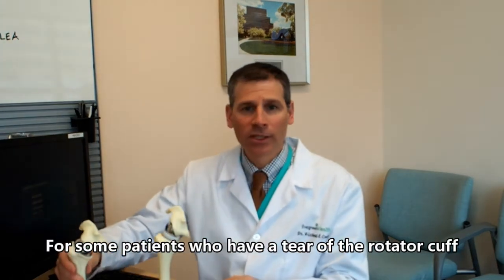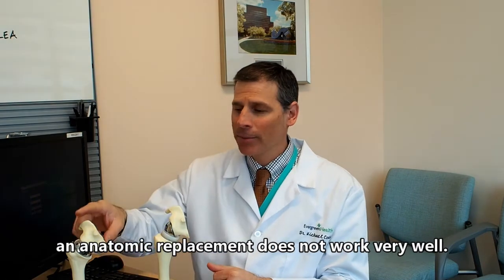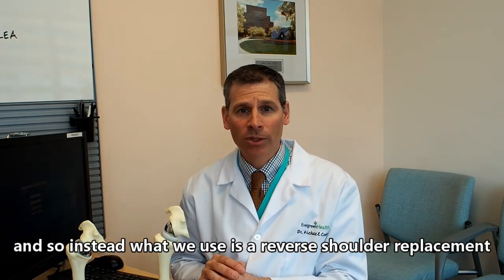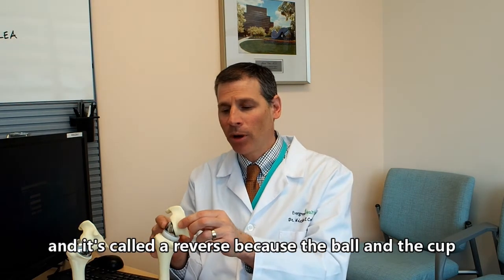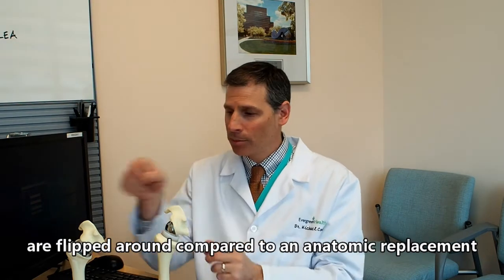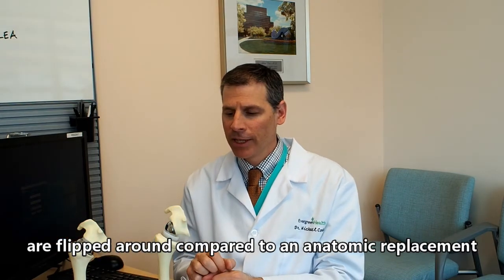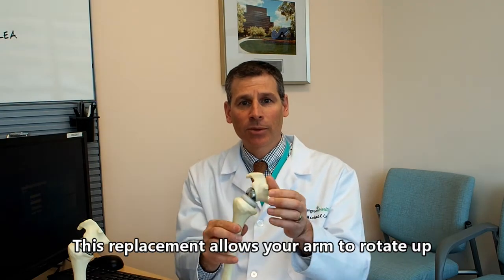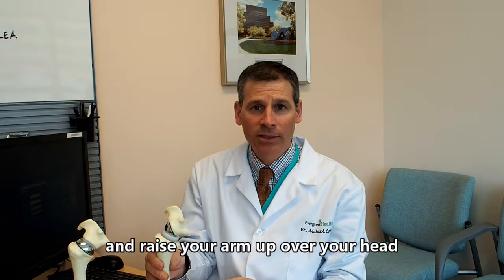For some patients who have a tear of their rotator cuff tendon, an anatomic replacement does not work very well. So instead, what we use is a reverse shoulder replacement. It's called a reverse because the ball and the cup are flipped around compared to an anatomic replacement. This replacement allows your arm to rotate up and raise above your head when your rotator cuff tendon does not work.